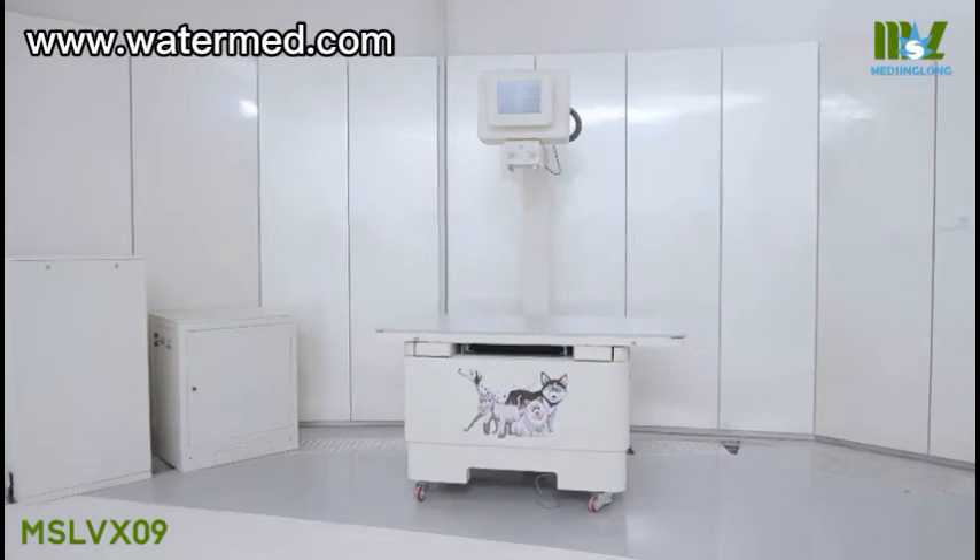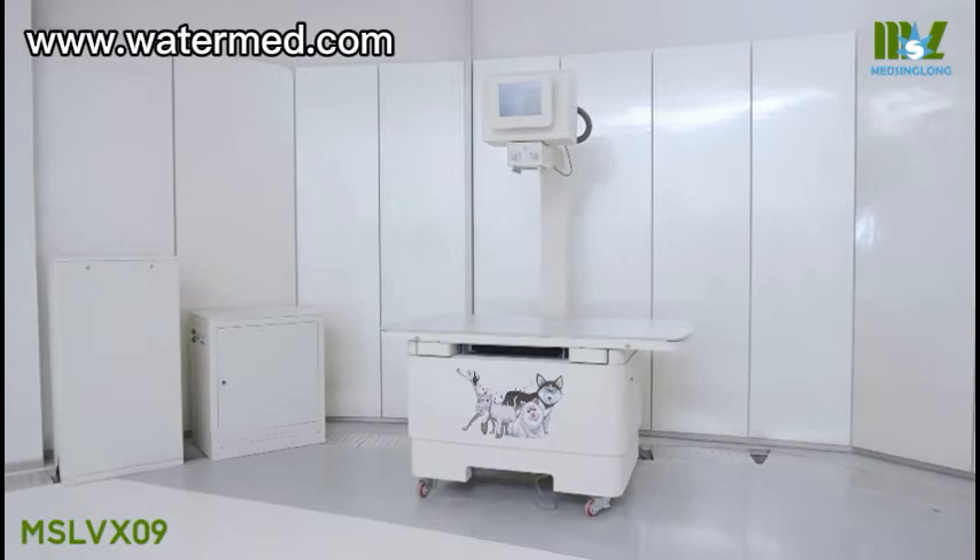This dynamic flat panel detector is highly recommended for both digital radiography and fluoroscopy for veterinary use.